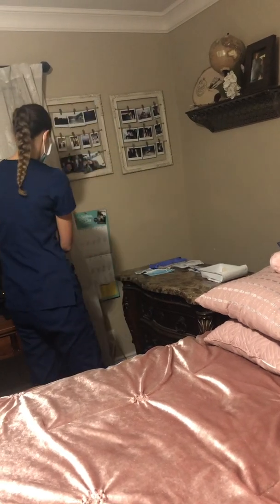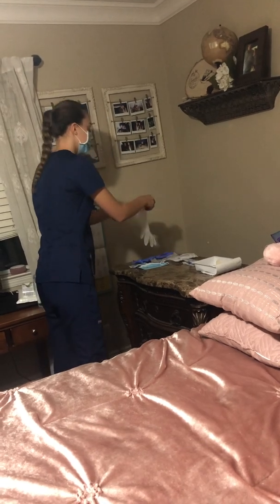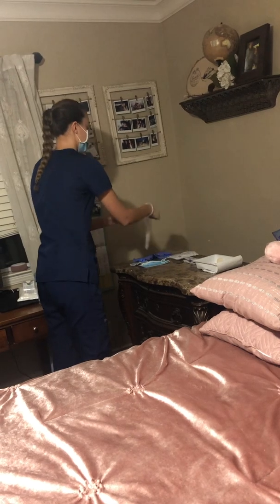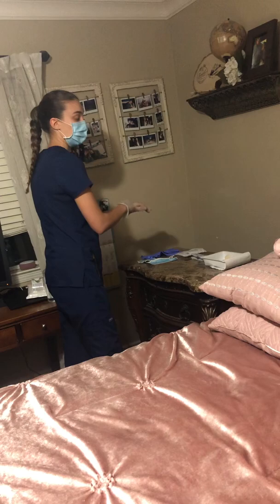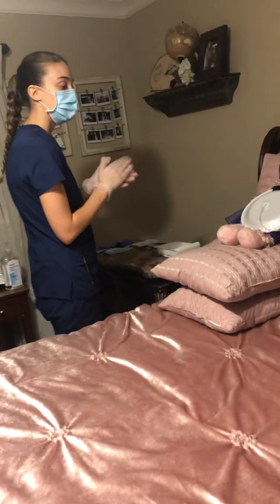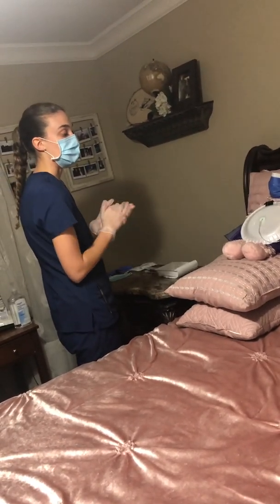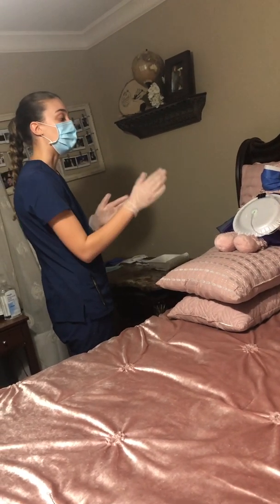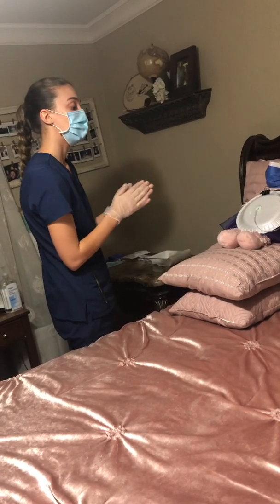Alrighty, I'm going to wash my hands. I'm going to don clean gloves. Alrighty, Mrs. Jones. So what I'm going to be doing is taking off this existing dressing, cleaning the site, assessing it, and then replacing the dressing and tape as well. Okay? So before I begin, I'm going to ask you to please turn your head to the side to prevent any bacteria from coming into the site. We want to keep it as clean as possible. Patient turns their head.